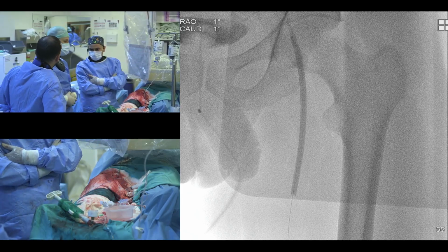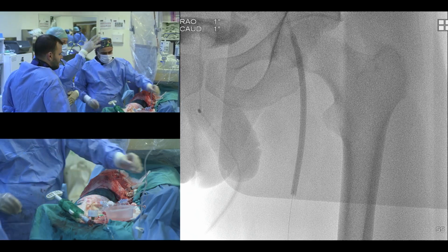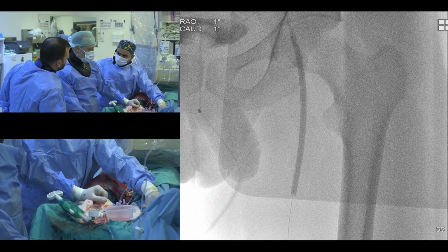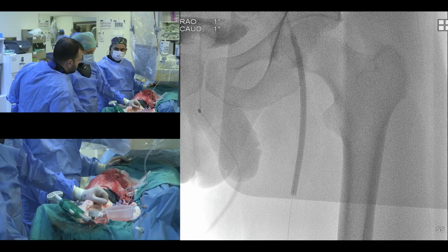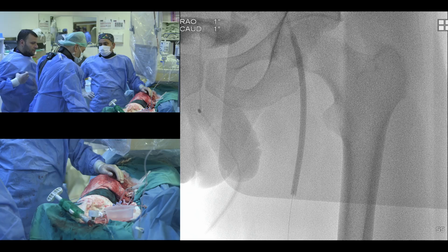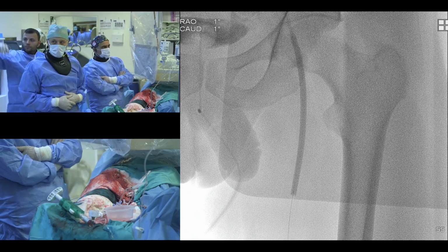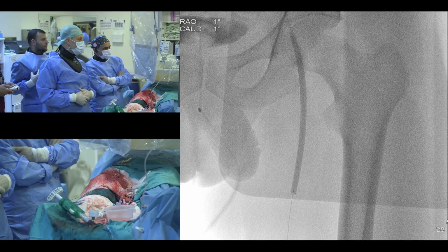Okay. He's doing good. We do arterial duplex in June of this year. We do arterial duplex in September. Boom, we have again a problem. Monophasic waveforms. So I bring him back in September, and we opened up the artery, distal SFA to popliteal, with drug-coated balloon. This time I used a biodegradable Esprit BTK stent in the ostium of the right posterior tibial artery, and we placed another stent in the ostium of the right peroneal artery, and we treated the popliteal end.